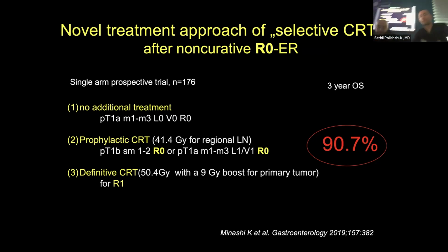One more question, dear Professor. Thank you for your nice presentation. The question is about circular and nearly circular dissection of squamous cell carcinoma. Do you use any prophylaxis of stenotic changes in the esophagus after ESD, at the time of ESD? And in which cases do you use this prophylaxis? Only with circular dissection, or also with semicircular or 80% circularity of the esophagus?